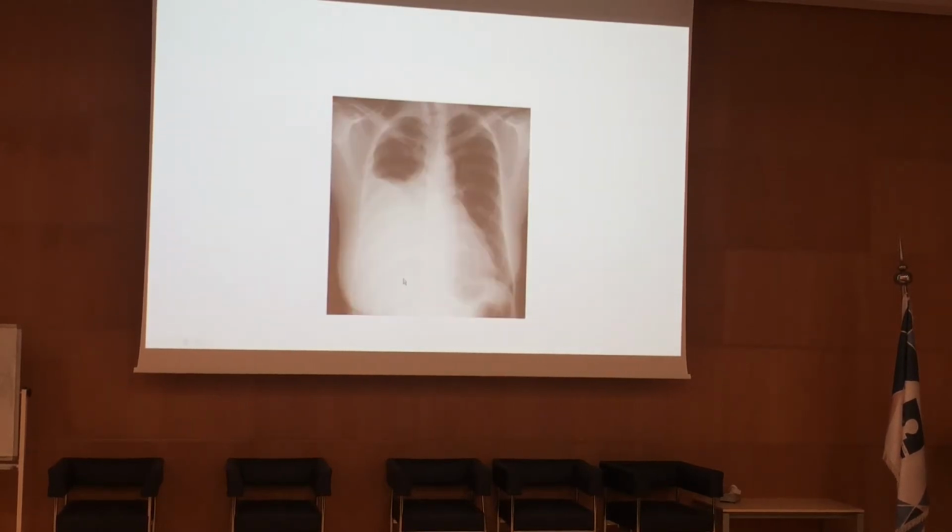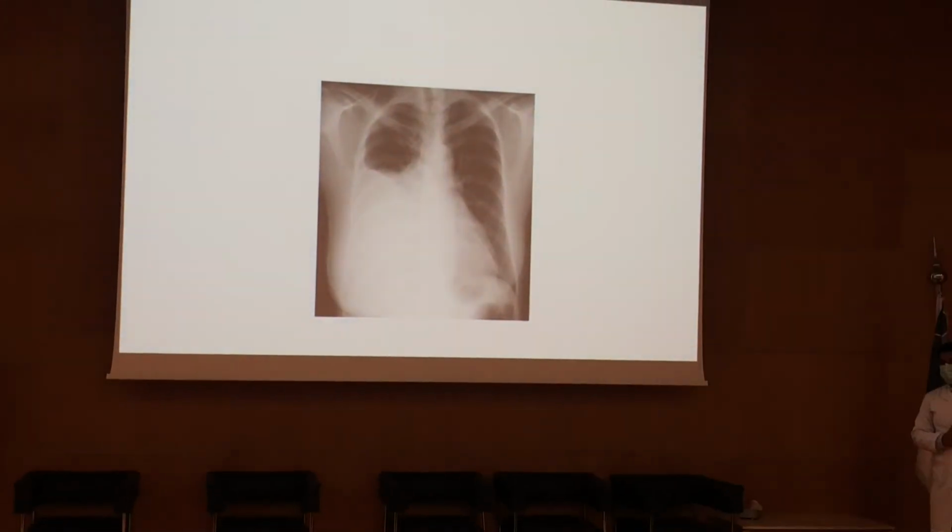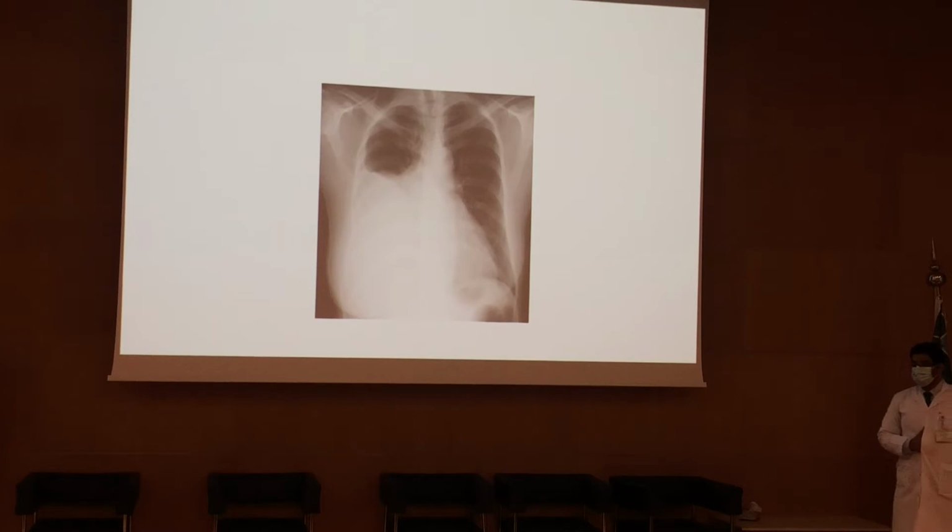Okay. And how about this one? Pneumothorax? What is it? Hemothorax. Why is it hemothorax? So how do you differentiate between fluid and air? If it's fluid, the picture will present the area.